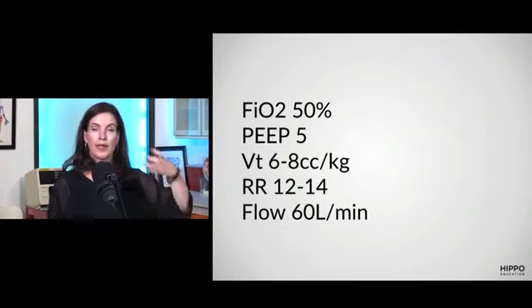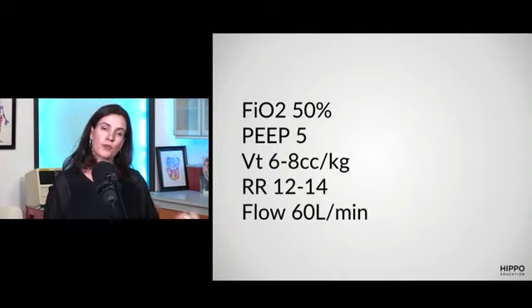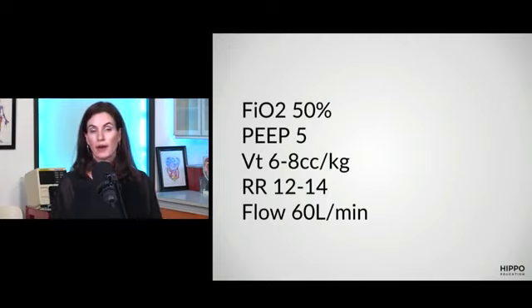The flow is how much air you feel blowing in your face. If you turn it up really high, patients feel like they're in a wind tunnel. If you have it too low, they feel like they're sucking and gasping for air. They stay air hungry. So you want to adjust the flow up or down until the patient seems comfortable.